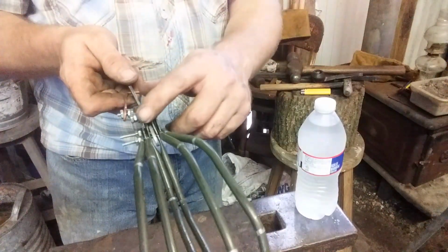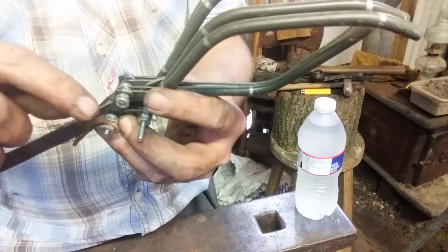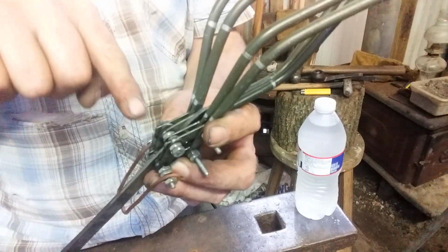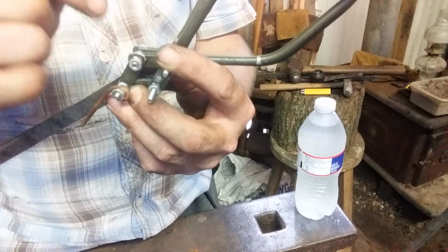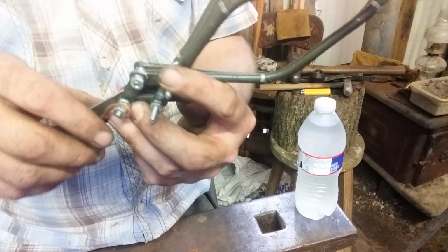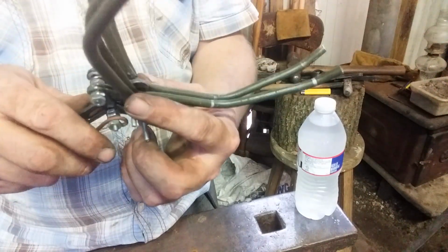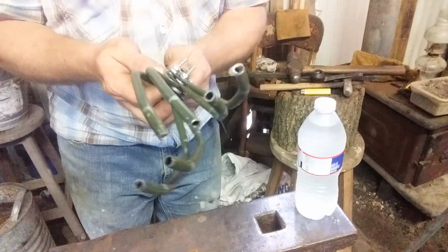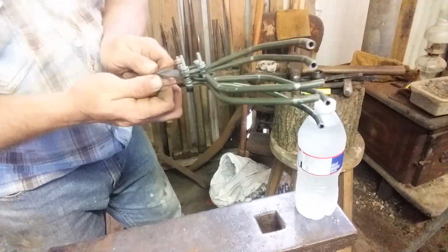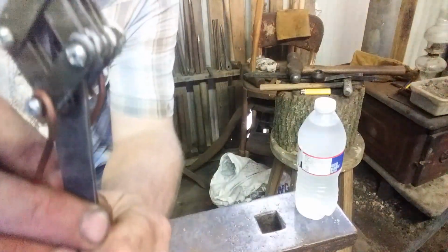I'm going to put bushings between all this. I'm going to extract one entire bolt at a time with it locked in position and clear them out with a drill bit, and as I install the new bolt I'm going to slip little bushings in between just to make it a little smoother and reduce wear. Anyway, that's interesting. Let's see how this is working.